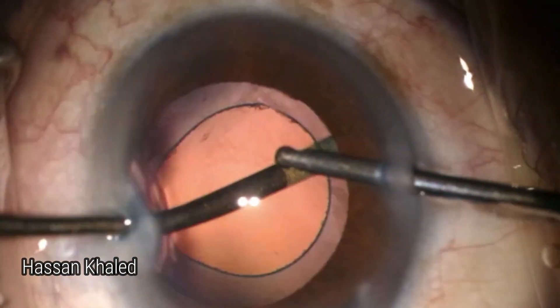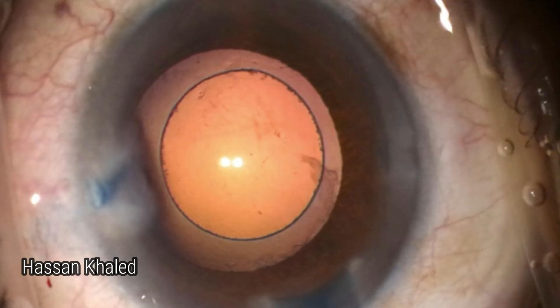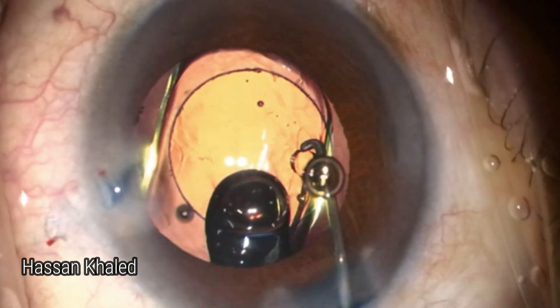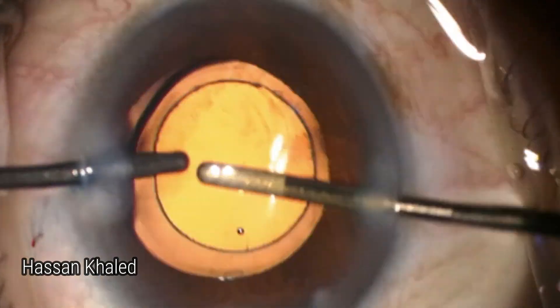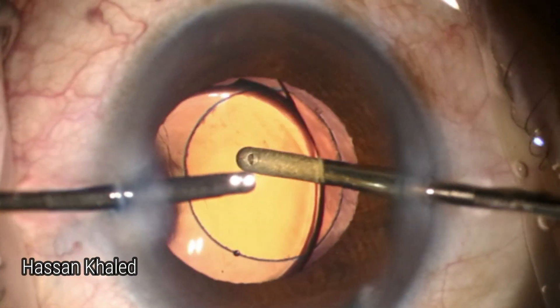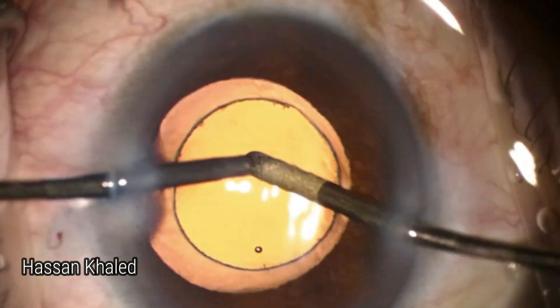Then injecting cohesive OVD to form the capsular bag and the anterior chamber to implant a single-piece hydrophobic IOL. Let us focus on the IOL — how it is secured properly inside the capsular bag. Look at that beautiful 360-degree overlapping of the rim of the capsulorrhexis with the edge of the optic of the IOL.